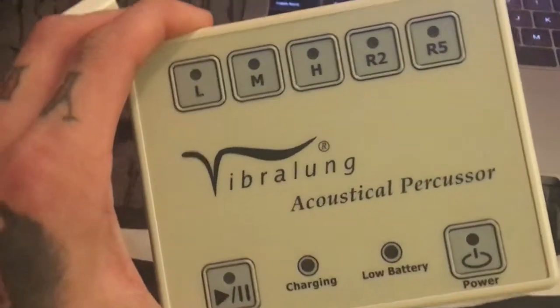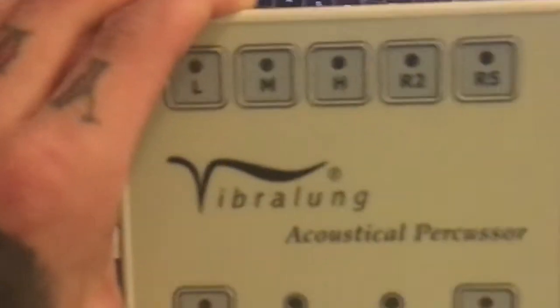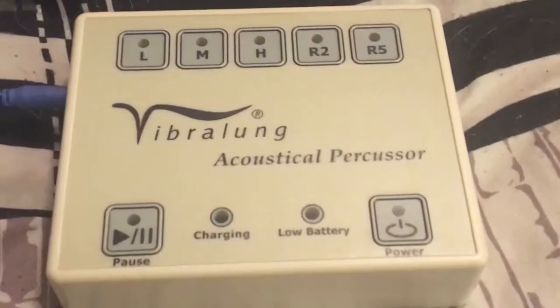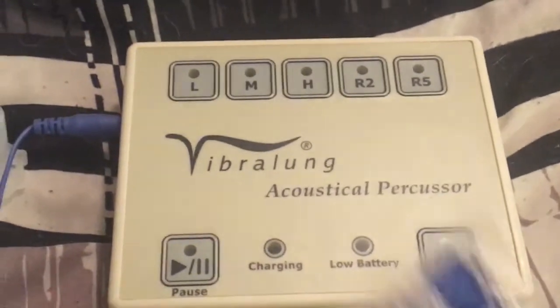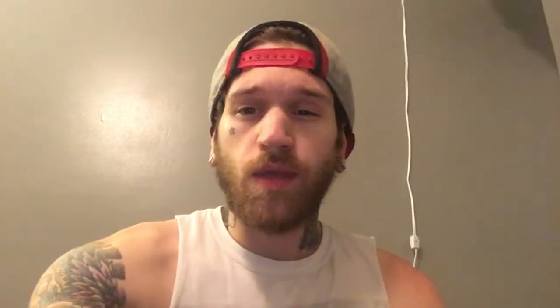This whole unit just charges — it doesn't have to be plugged into the wall or anything. You just plug it in, charge it up, and you're ready to go. The whole thing's pretty portable; it's just this blue cord that plugs into it and the mouthpiece, and that's really all there is to it. But when I was unpacking it, what I thought was odd was it comes with a pair of earplugs. I'm kind of thinking to myself, what the hell would I need earplugs for? You're about to find out.